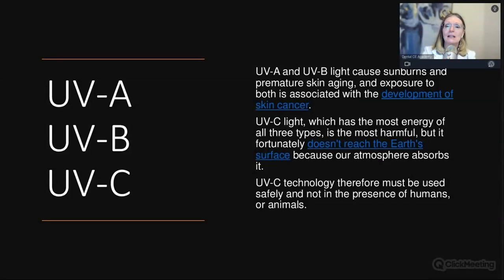UVC light has the most energy of all three types, but it's the most harmful. And usually it doesn't reach the Earth's surface because it's absorbed by our atmosphere. But it can be man-made with devices to do the good of infection control and mitigation for microbes and so forth.